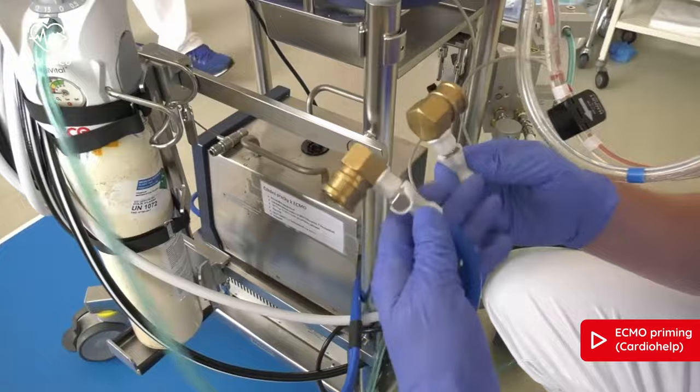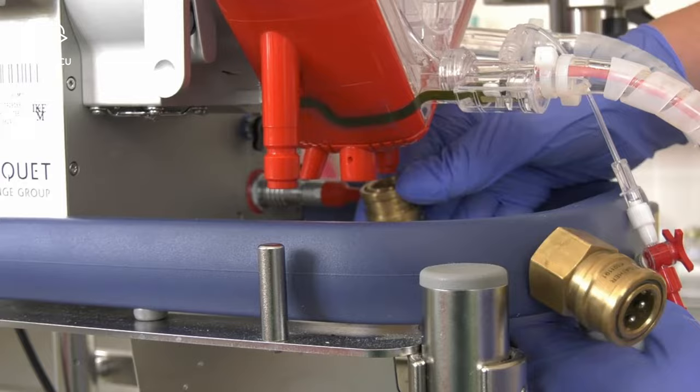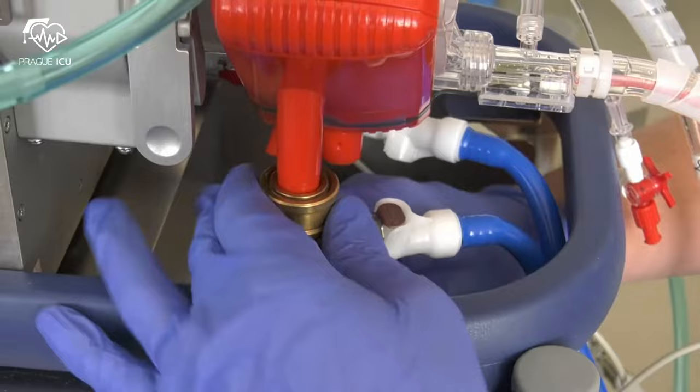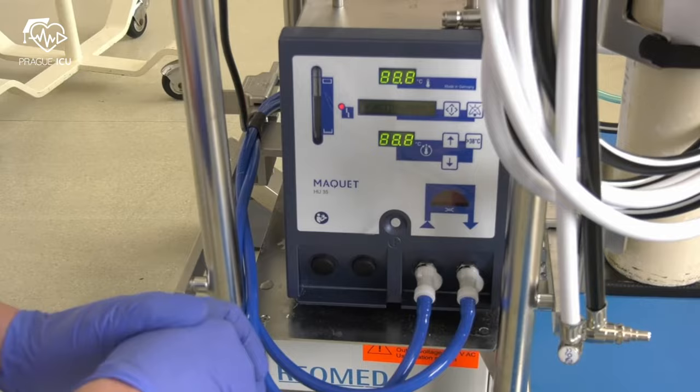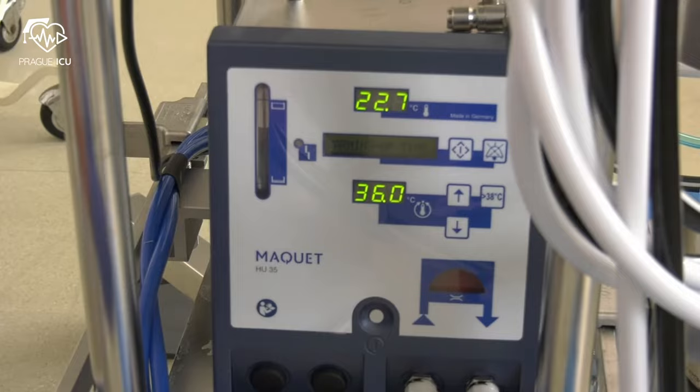Connect the water lines from the heater unit to the Cardiohelp module. Before priming the set, run water through the heat exchanger and check for any leaks. Make sure that the water level in the heater is sufficient. You can adjust the temperature if needed.